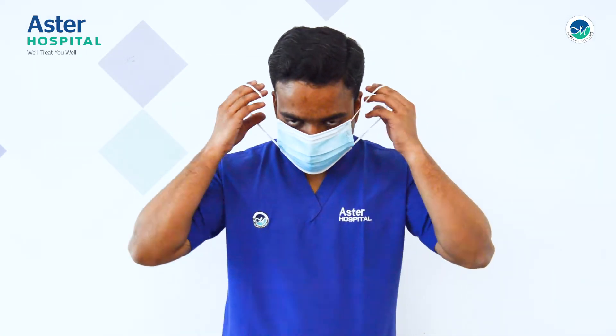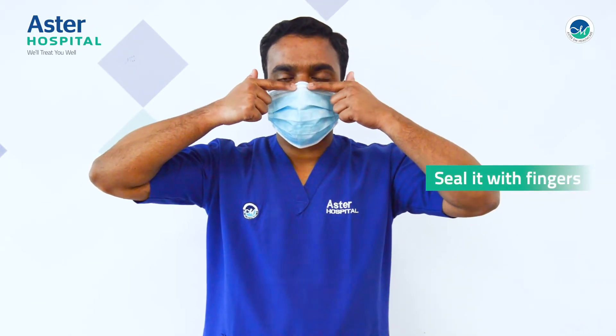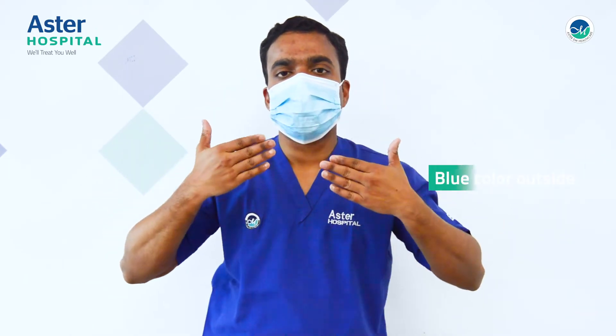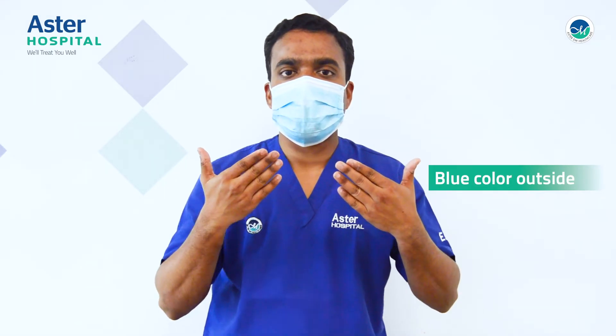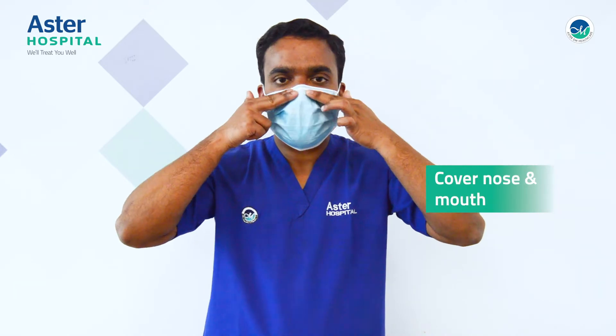You have to wear the mask like this. There will be an aluminum wire that has to come on the upside, and the blue color part of the mask has to face outer, and the light color part has to go inner. This is the way of wearing the mask.